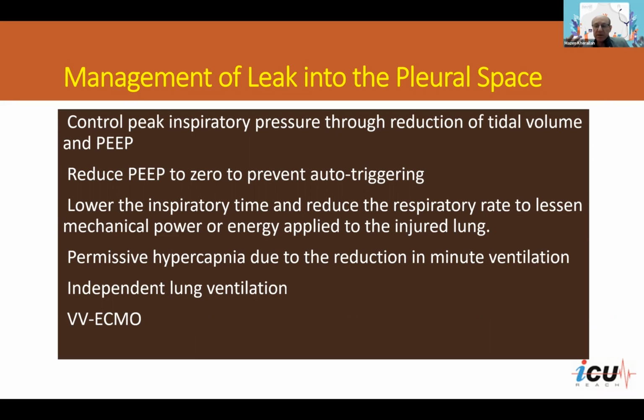If you want to use it, you're going to minimize the mean airway pressure to a very low level in order to minimize the leak. So think about the mean airway pressure in high frequency ventilation as similar to the PEEP level, because that is maintained at all times. I don't think it's been studied, but theoretically, if you're dealing with a big leak, it's not going to benefit.